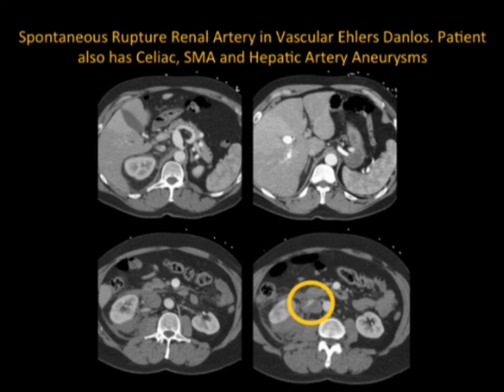Now, what else? Well, we can talk about aneurysms that go beyond the renal and splenic artery, and there are many different circulations. And so splenic artery aneurysms are one of the things we'll think about, including hepatic artery aneurysms.